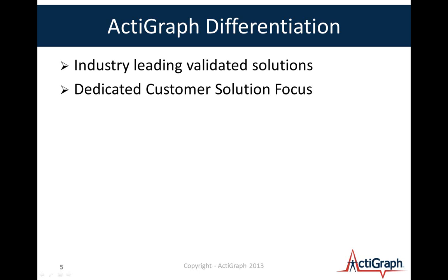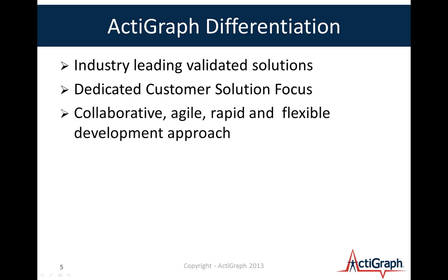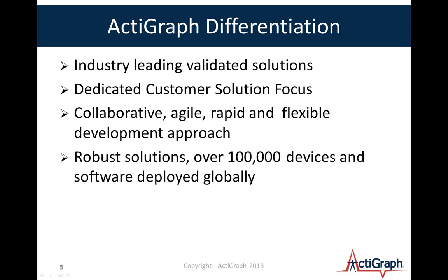And so we've been involved in some very large studies and have a lot of experience in deploying devices and hardware and software solutions to large longitudinal study scenarios, and we've done well with that. About 50% of our business is international, and the other 50% or so is stateside. So we have a very diverse background in those first two bullets there. Our company is still fortunate enough to be able to collaborate and develop some very flexible outcomes quickly. We're a small team, we're an agile team, and we're able to produce rapid approaches to new ways of collecting data and pushing forward solutions to actigraphy monitoring.